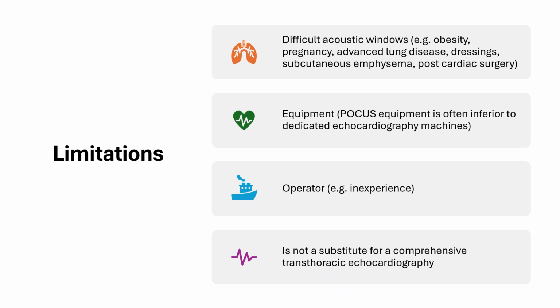Of course, cardiac point-of-care ultrasound is an essential bedside clinical tool, but everything has some shortcomings. Here are some of the limitations of cardiac point-of-care ultrasound, which include difficult acoustic windows in obesity, pregnancy, advanced lung disease, presence of surgical dressings, subcutaneous emphysema, and post-cardiac surgery.